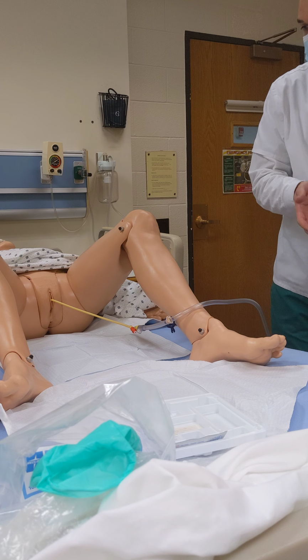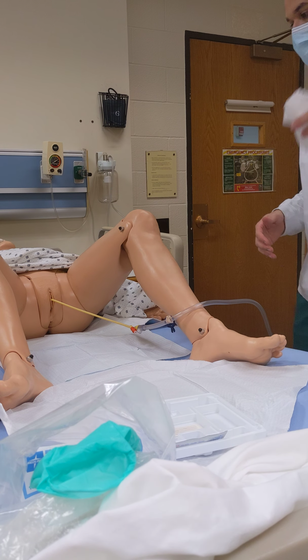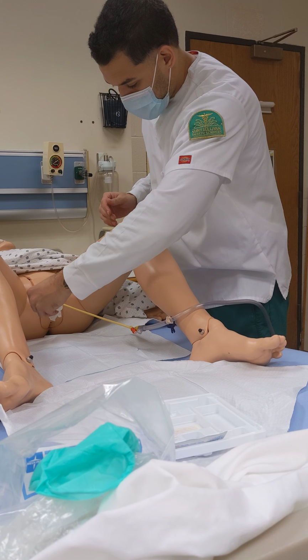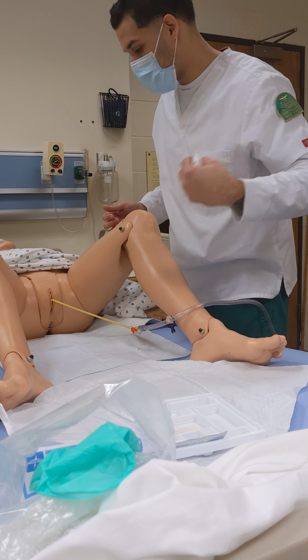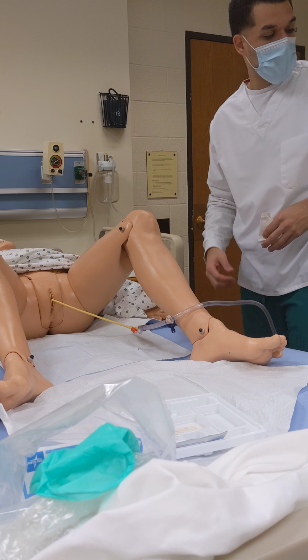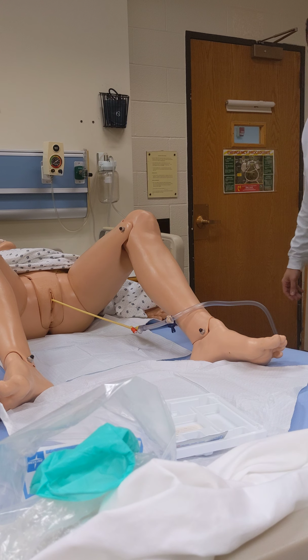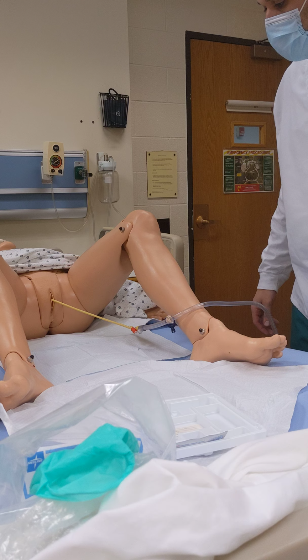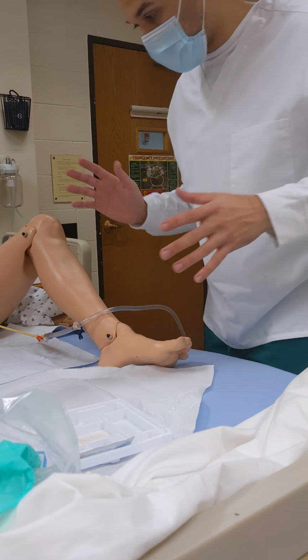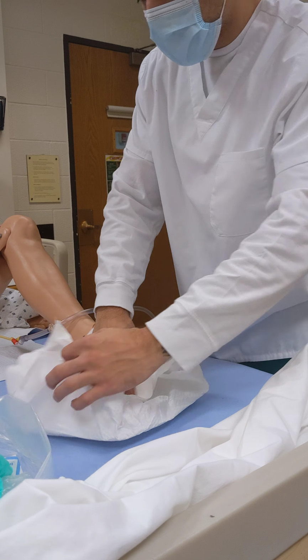Taking my gloves off, hand hygiene, gloves again, so that I can perform peri-care. Fortunately, I only have one of these, so just imagine I had more washcloths. Going to begin by cleaning the furthest side, disposing of the washcloth, closest side disposing, and then the center, and disposing into the appropriate receptacle. After all that is complete, I will then begin, since this is no longer a sterile procedure at this point, to remove all of the materials I was working with.